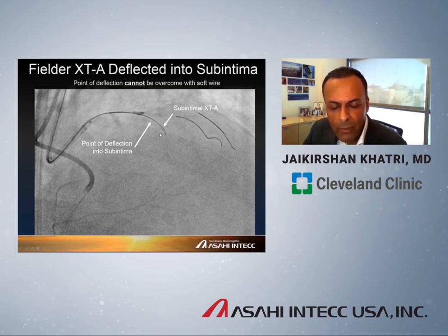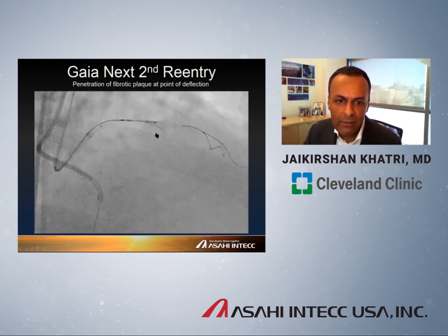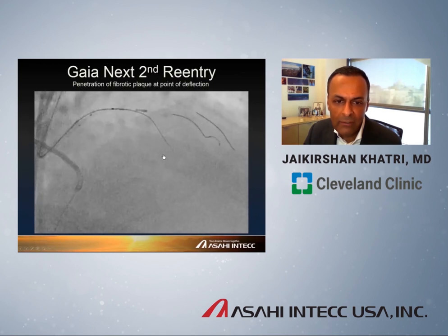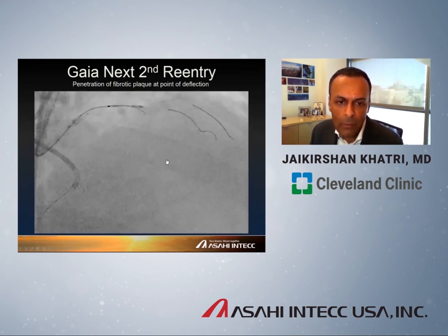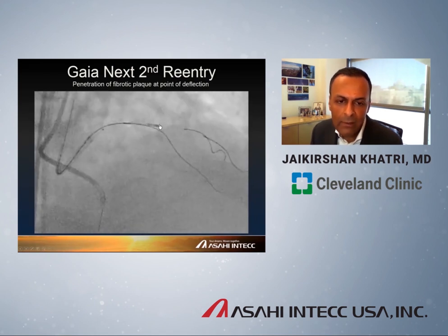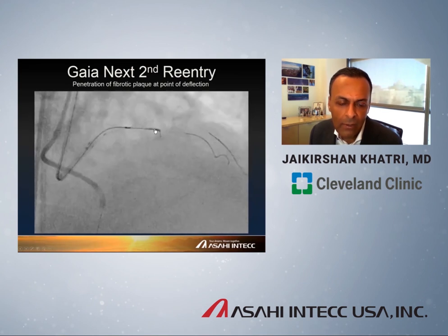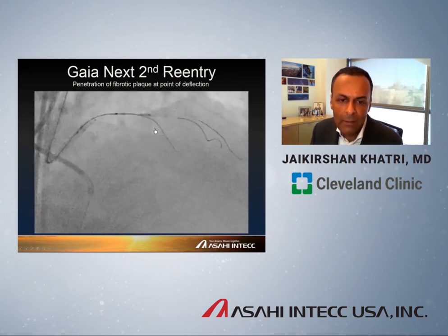This is a patient where we did an IVUS-guided puncture for a LAD CTO. With an XT-A wire, we quickly got sub-intimal. Under the XT-A, you can see the contrast of where we needed to be, and we think we roughly deflected off the cap. This is where super high torque response wires are very handy. Using a Gaia Next second, we engaged that area where we had deflected, and using the torque response — observing where it deflects and doesn't deflect — we were able to quickly reenter the LAD with very high confidence.